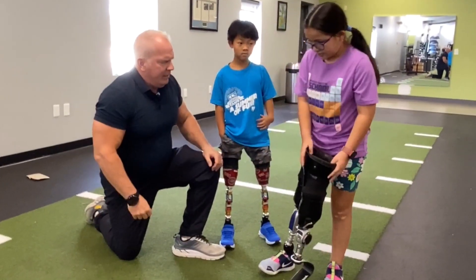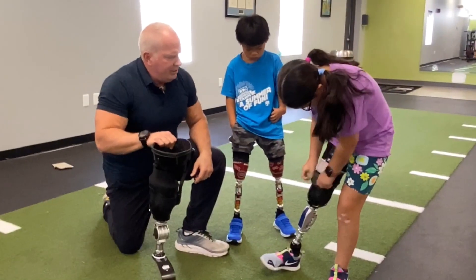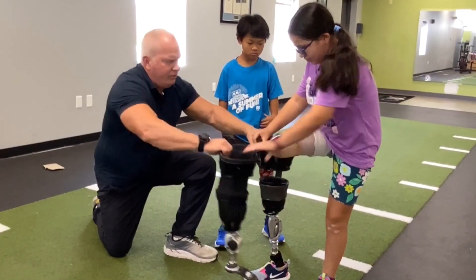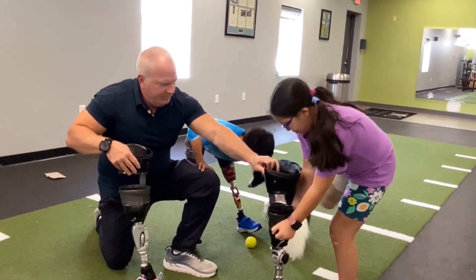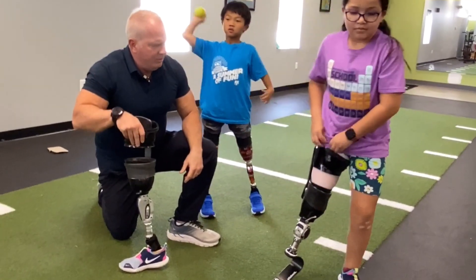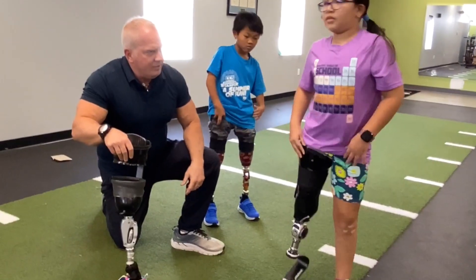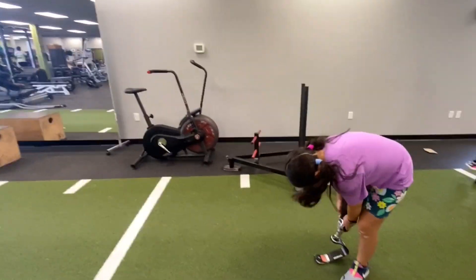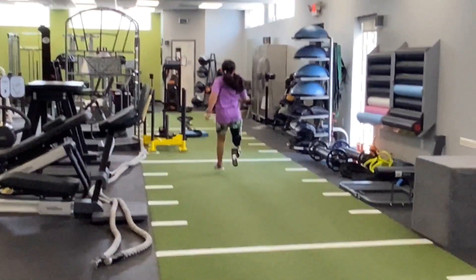Azalea, can you put that running leg on? We can watch how fast she can do that. Azalea is able to just pull the sleeve down — that allows the suspension to come loose. Then you're able to go down into it, pull the sleeve back up, and that allows the suction to take place. Azalea, do you want to run down there for us real quick? Got to unlock it. And come on back. Very good.